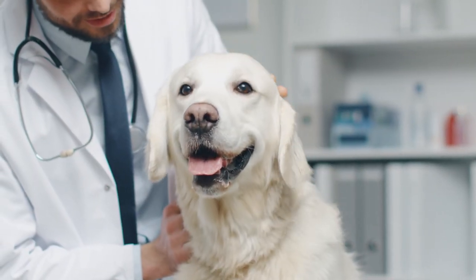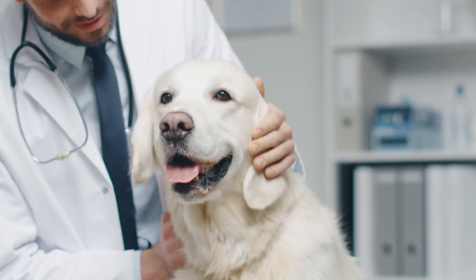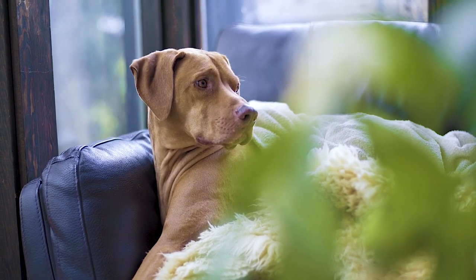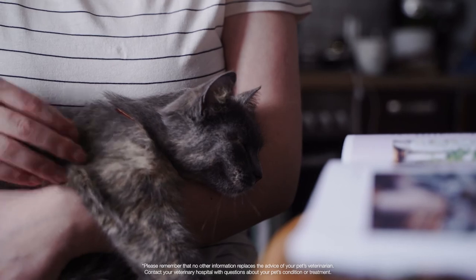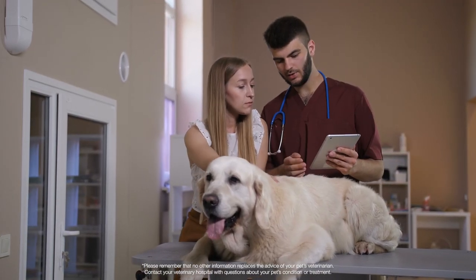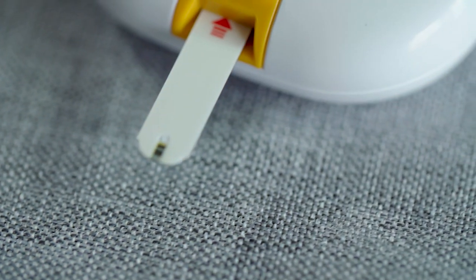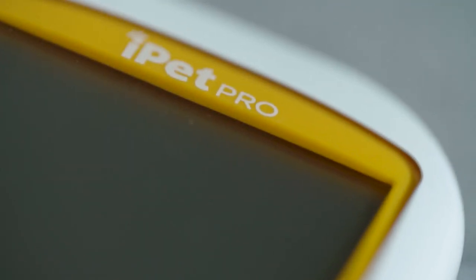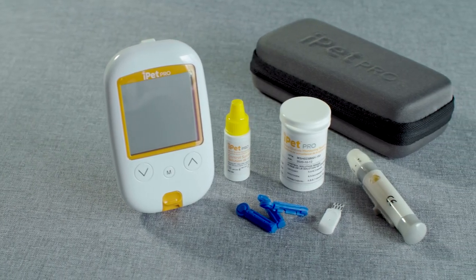Finding out your pet has been diagnosed with diabetes can be an overwhelming experience. With the proper care and treatment, your pet can live a long, happy life. Your veterinarian will diagnose and recommend a treatment plan for your pet that may include at-home blood glucose testing with the easy-to-use iPet Pro blood glucose meter.